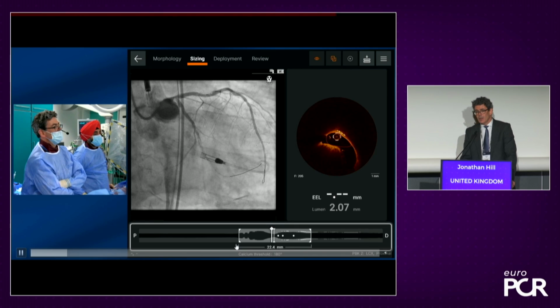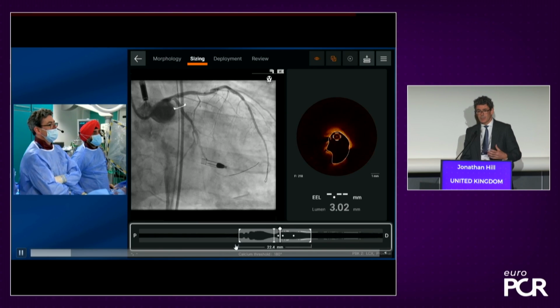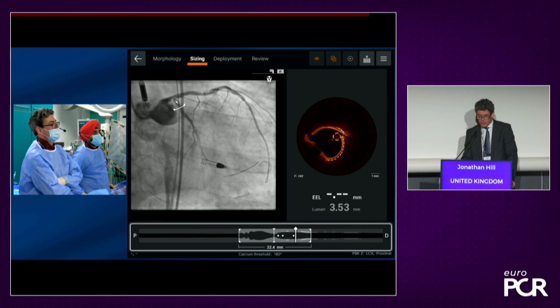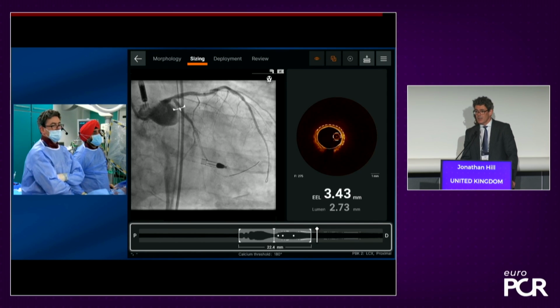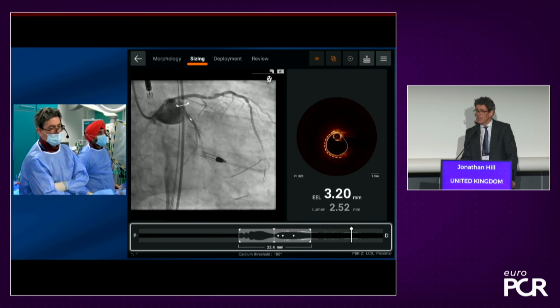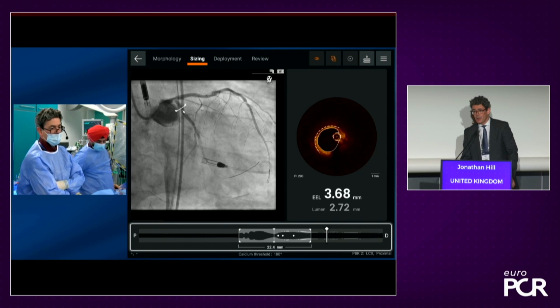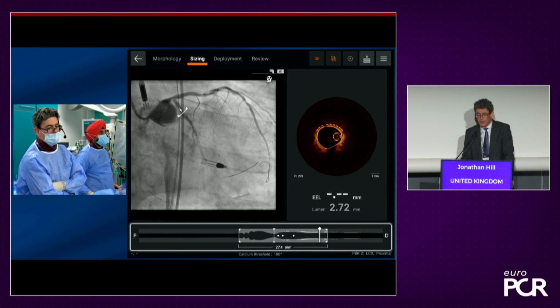And as we've heard from the previous case, to do these cases in patients who are hemodynamically vulnerable, and especially when we're doing left main intervention in the context of severe LV systolic dysfunction, there's probably a clear advantage to be able to do this case as safely and as efficiently as possible, avoid the low flow complications you may get with left main intervention, and to be able to keep 2 wires in. So it's become our default strategy now to treat these cases with IVL first.